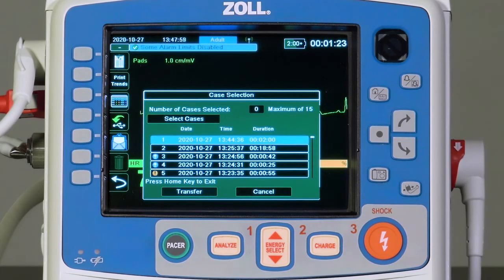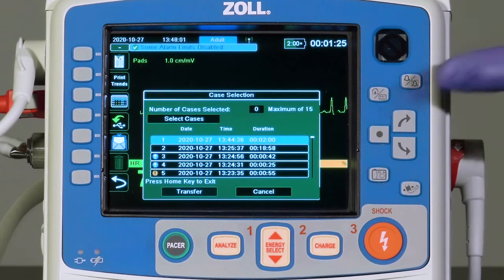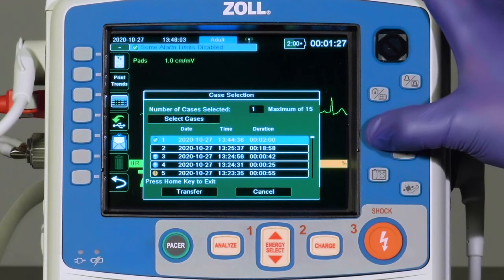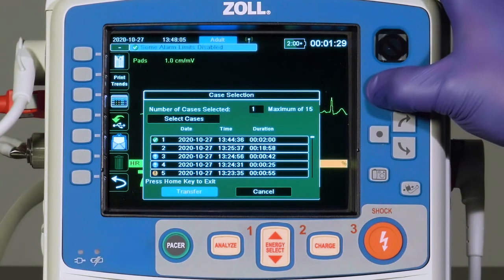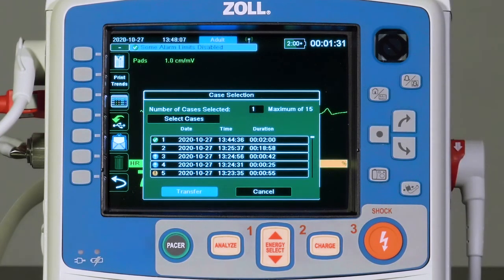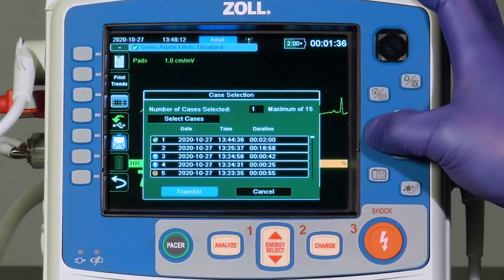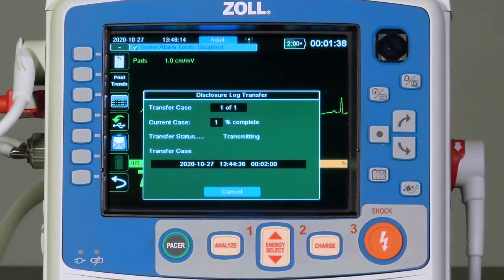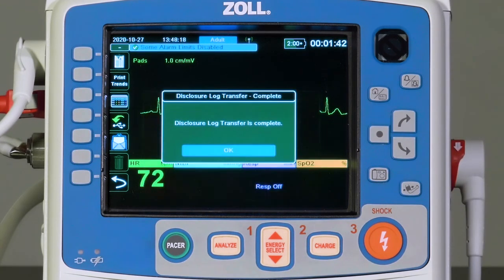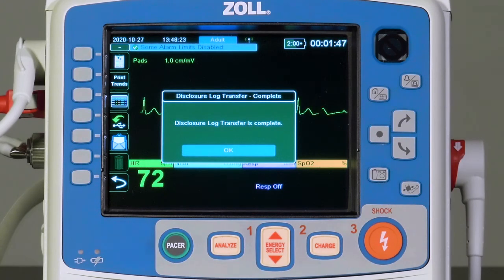After selecting the desired cases, select the Home key to exit the Select Case menu. Pressing the Home key highlights the Transfer key. Press the Transfer key to start the process of transferring the case or cases to Zoll Online. A progress bar will be displayed during the transfer. When the transfer is completed, the message 'Disclosure Log Transfer Complete' will be displayed.